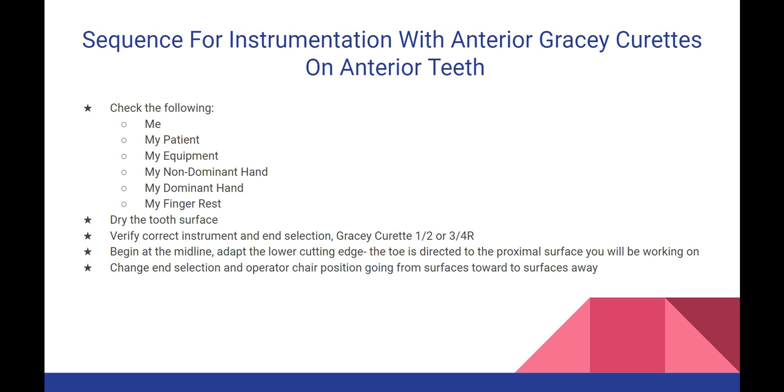Begin at the midline. Adapt the lower cutting edge. The toe is directed to the proximal surface you'll be working on. Change end selection and operator chair position, going from surfaces toward to surfaces away.